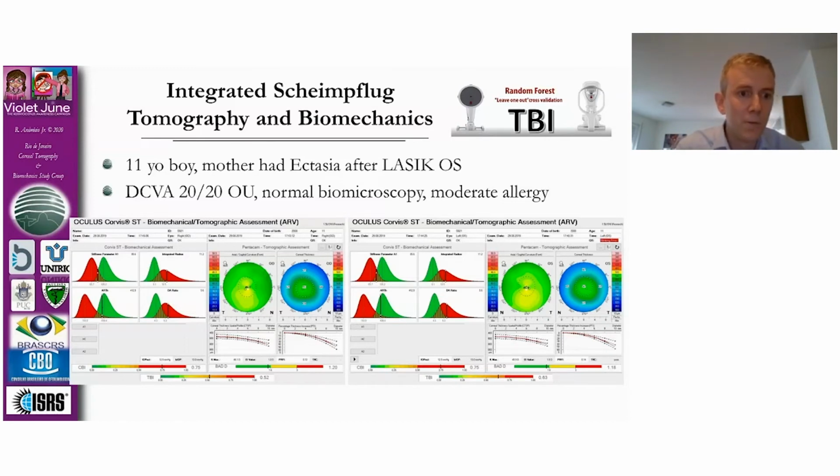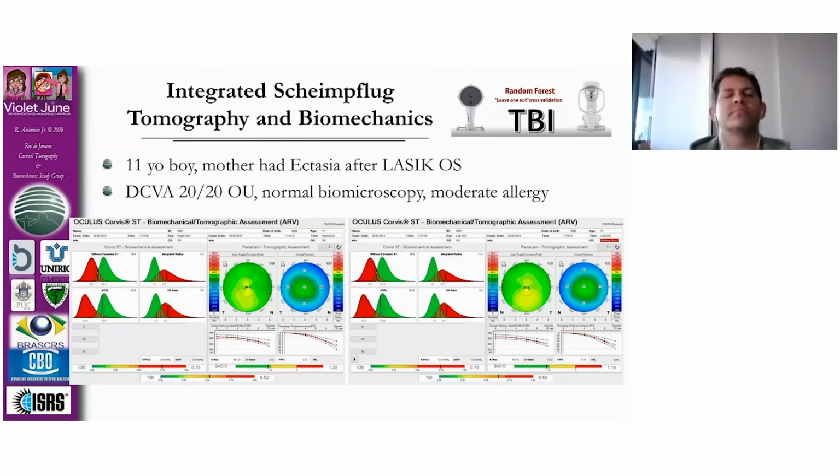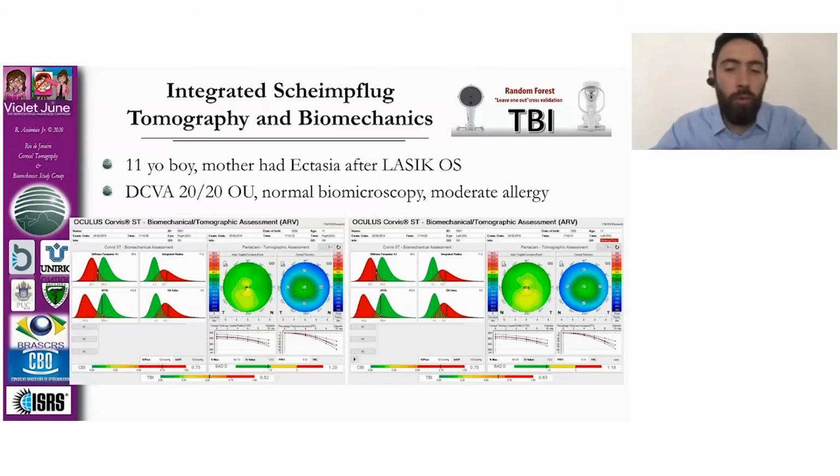Can I comment on one thing, Sven, regarding this? I selected the slides for Shizuka. Maybe I'm a little bit out of step with everybody, but I don't think we should give a message about which index you should trust in case they differ. Because let's go to a completely different subject.